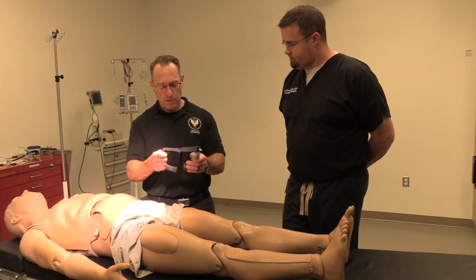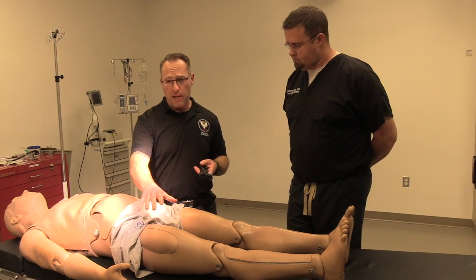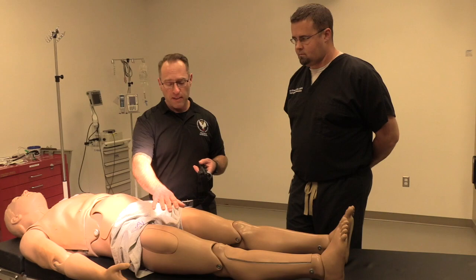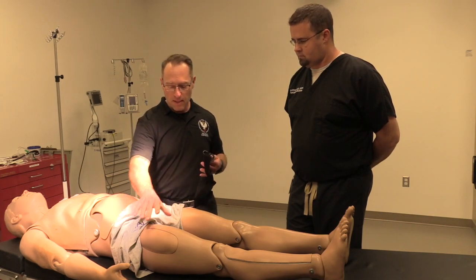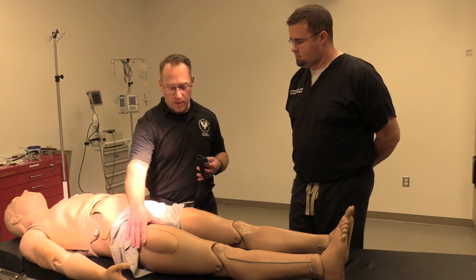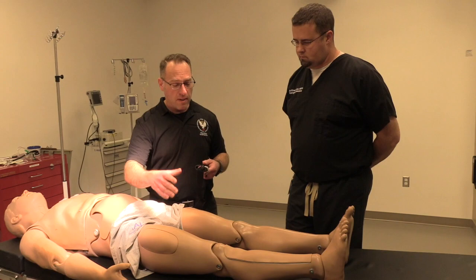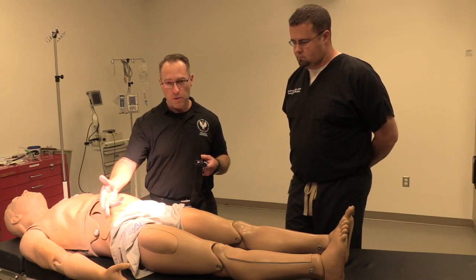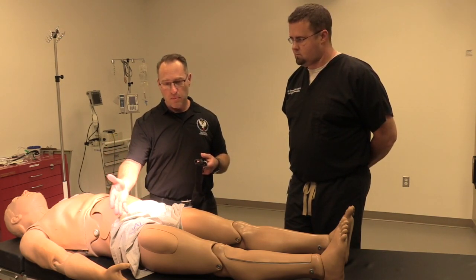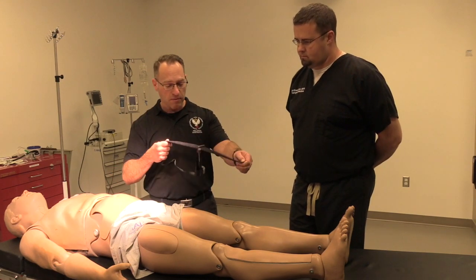When it deploys, you're going to pull it apart, and depending on if we're in rescue task force operations where things are a little chaotic, it's acceptable to apply the tourniquet as high as you can get up on the limb over a person's clothing, making sure there's nothing underneath in pockets or things like that that would obstruct it. In any other situation, you want to completely expose the injury, apply some direct pressure if we can, and then apply the tourniquet 2 to 3 inches above the injury.